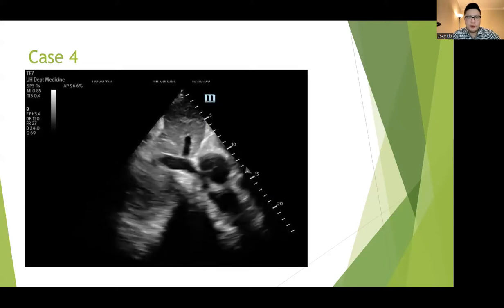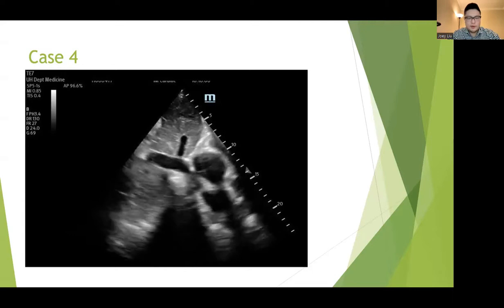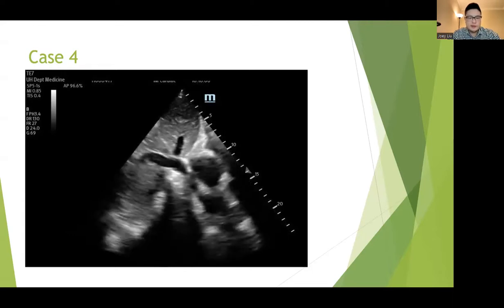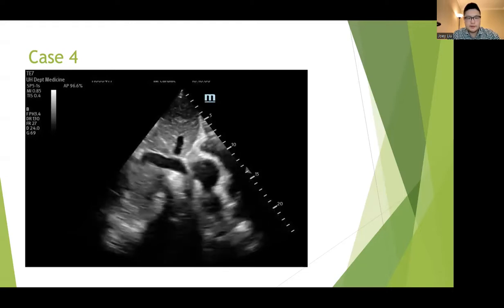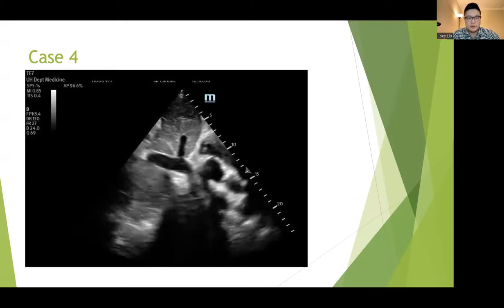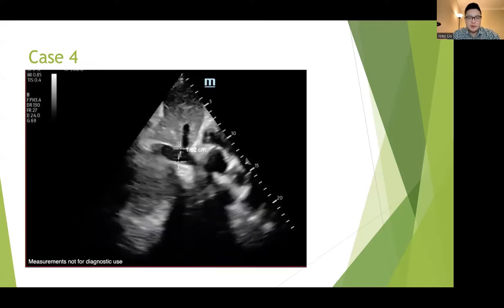And going into the IVC assessment itself. I would say I was probably close to the true center of the axis, but again, going back to the pitfalls, the tube of the IVC seems to change a little bit with the respirations. Maybe I was just close to the center, but not quite there. But even if I were to take a measurement here with the standard IVC location just beside the hepatic vein, it's only 1.2 centimeters.